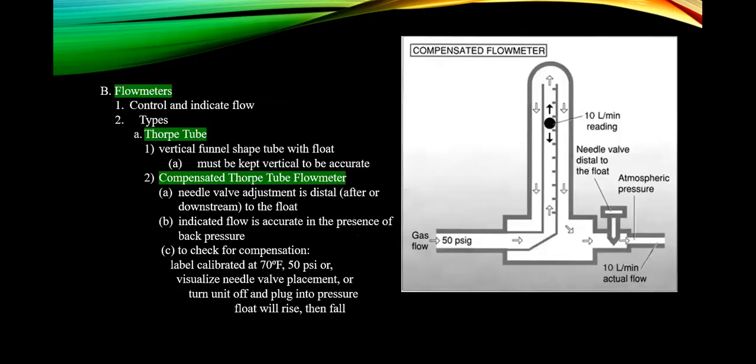All right, this is the one that people had problems with. Compensation of the Thorpe tube. Is the Thorpe tube compensated or not, right? Well, bottom line is, in a compensated Thorpe tube, the needle valve is distal to the float. Look at your picture. The needle valve, look at this needle valve right here.